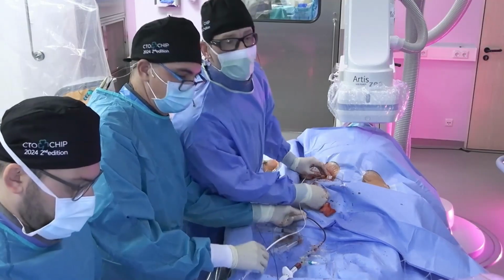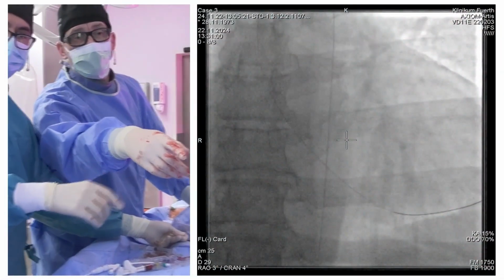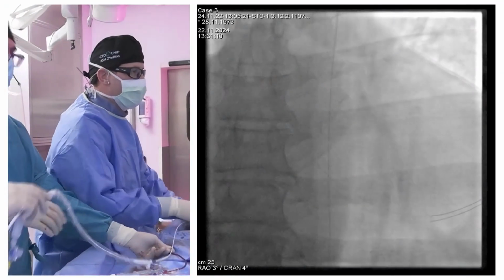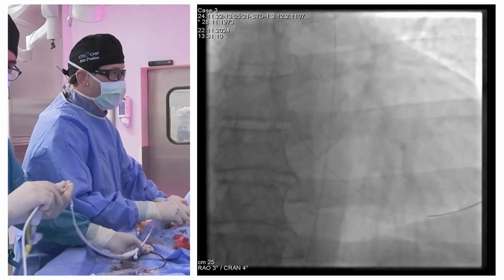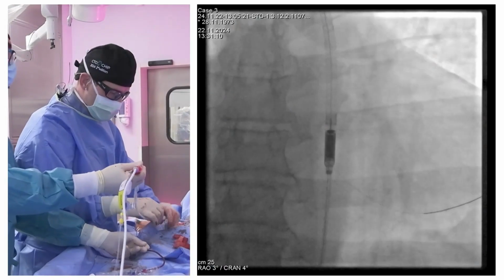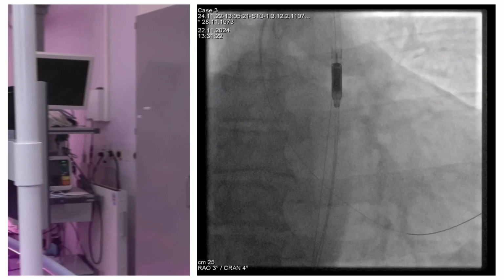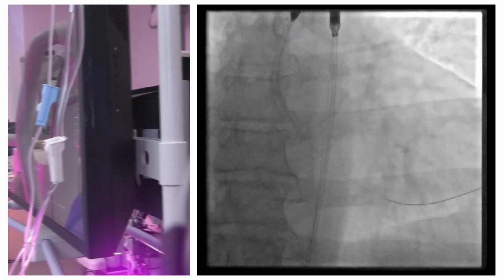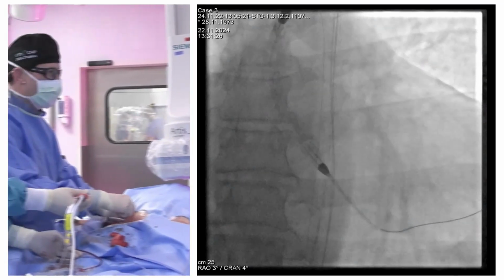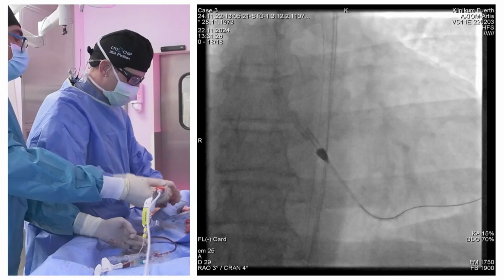Any other suggestions? Who would start with an Impella in this case or not? From the panel, perhaps? In this case we can discuss a staged procedure. If we have success in the antegrade procedure, we can leave the Impella in the box, and if we have to change to the retrograde way, then we go to the Impella procedure. It's another option if we want to avoid this big femoral vessel access.